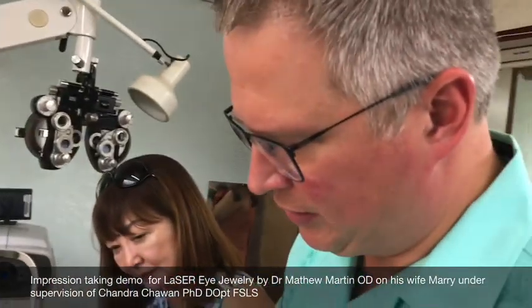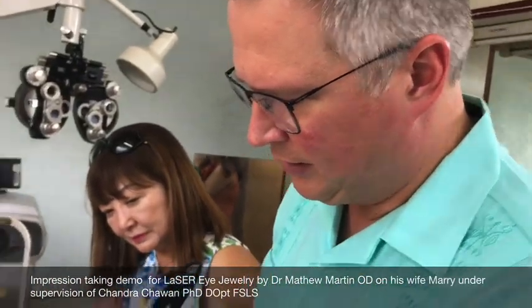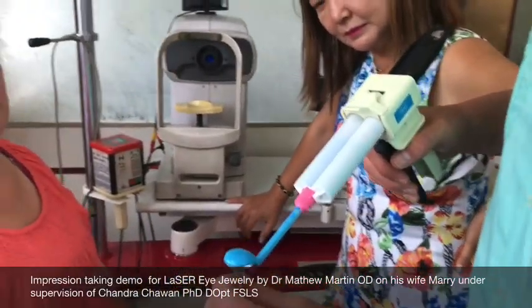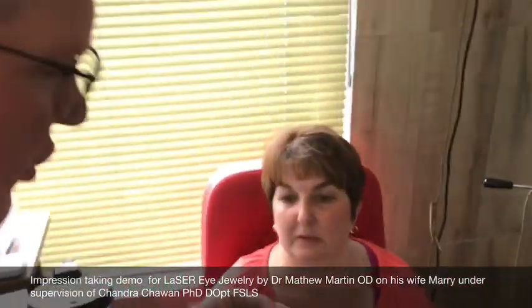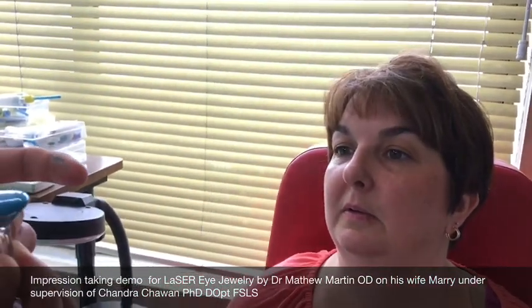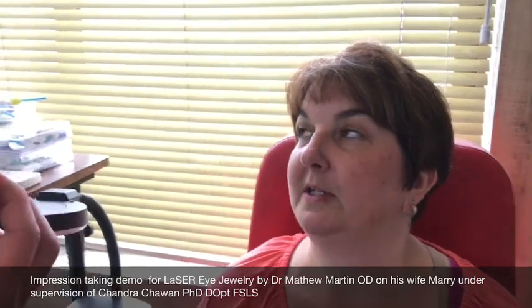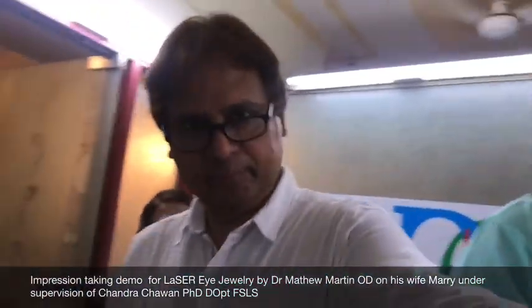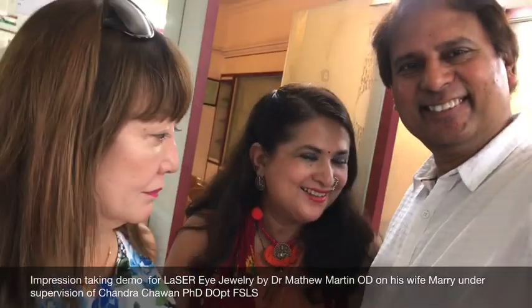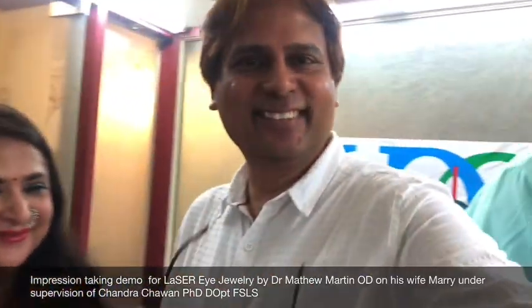I'm just going to fill that all the way up, and when we pull back, we pull it back to the side like this, and we try not to put it on the floor. This notch will be vertical. We're going to make sure there's no bubbles — yep, there's no bubbles. I did a good job with this one because I listened to the advice from Chandra. Chandra is an amazing instructor, thank you Chandra.